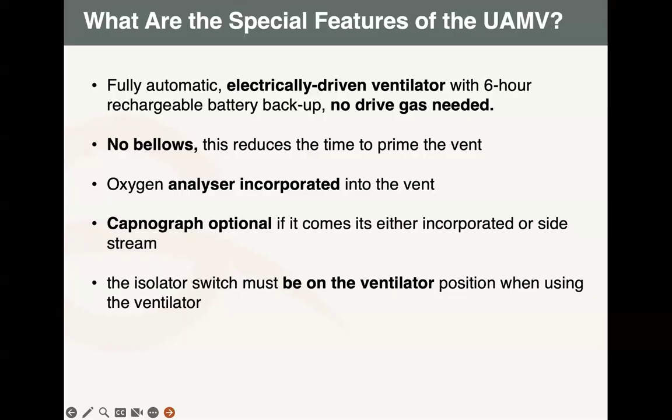If you leave it on the bellow side, then you might not be doing the right thing. Always remember, when you go to vent, you switch it so that you reduce the resistance, and then you open up free circulation of the ventilation toward the patient. Next slide, please.